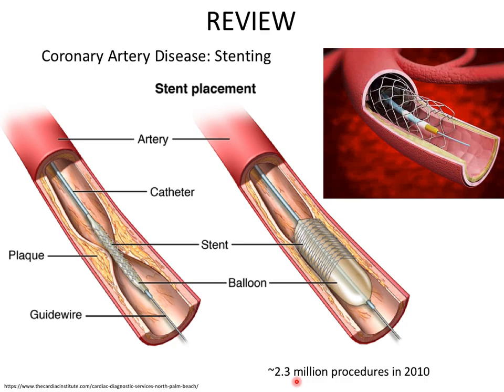It doesn't cause any bulging of the vessel, does it? Or is that a possibility? That's a really good question. Say this is very firm, it's been there for a long time, has a lot of calcium in it and other things. If I blow this up, does it really look like this on the outside, completely flat, or does it bulge out?